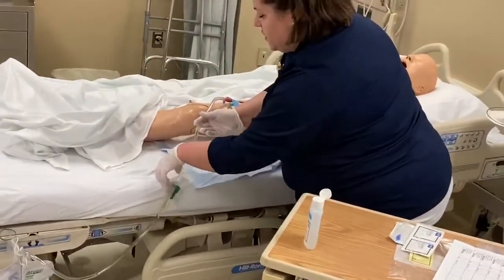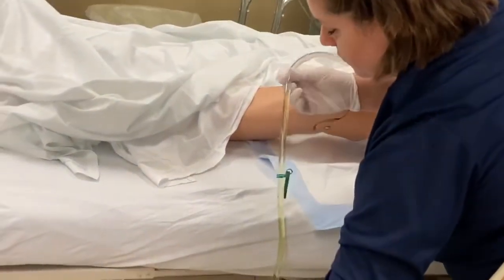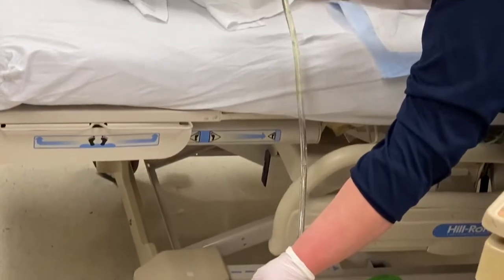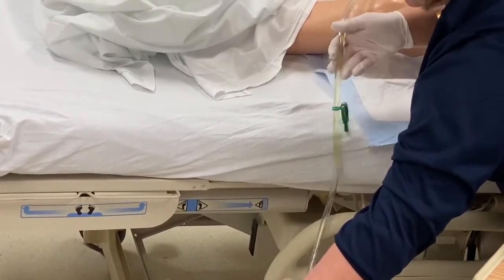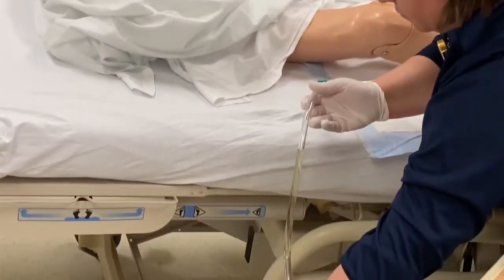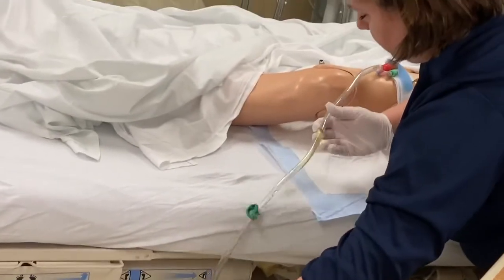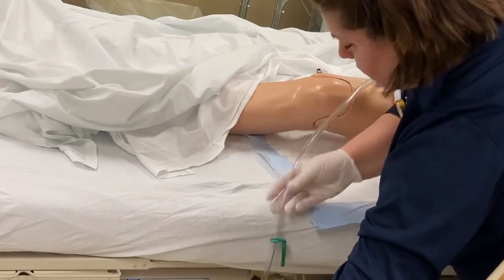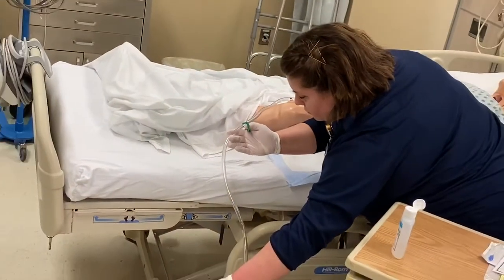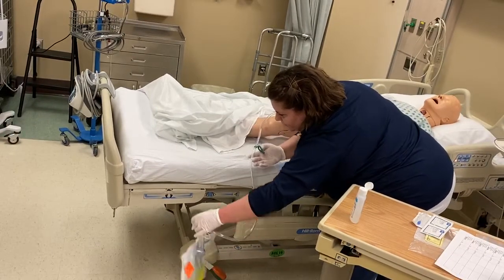So I'm gonna drain this urine into the bag. And once this is all in the bag, I know that my sample will be nice, fresh, new urine.